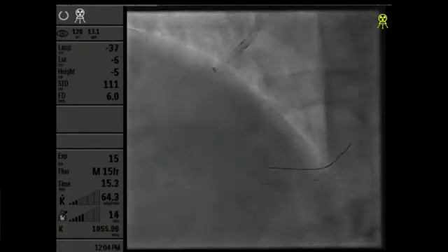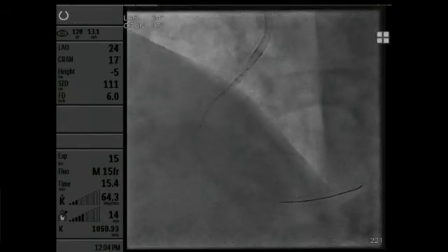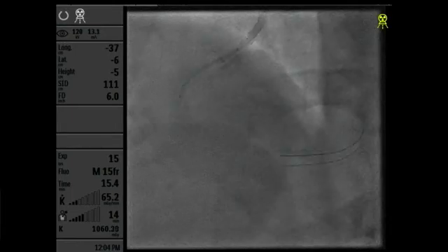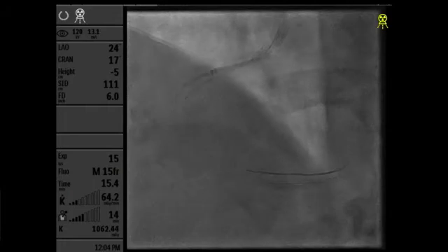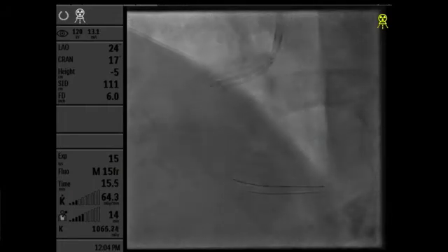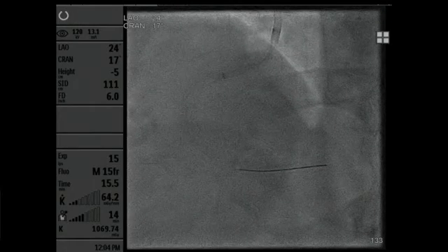Take the GuideLiner back down. Be careful not to push it too much. I'll try to get the GuideLiner regular. Can I have a regular balloon, please? This is a 22. Last week we wanted to strip the stent over the. Yeah, no, I'm with you. Can I have a balloon, please? It's just the rigidity. You haven't changed the compliance in that segment at all. So you're still, yes, very rigid.